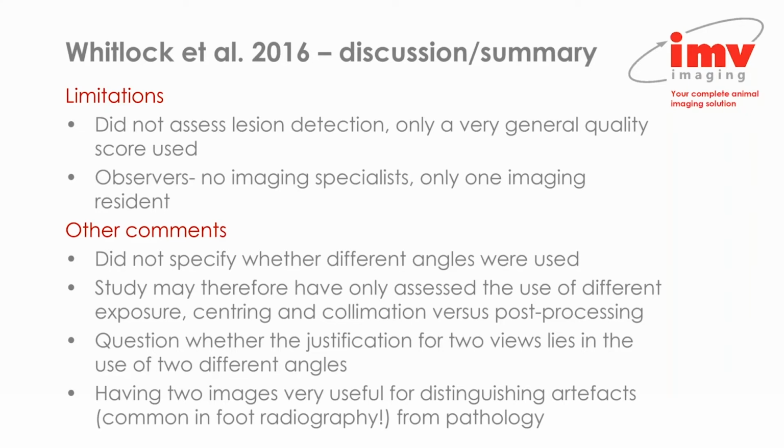So the study may have been only assessing the use of different exposure, centering and collimation versus simply doing post-processing on an existing view. And I would question whether the justification for using two views lies in the use of two different angles. Because I find that having two images acquired at different angles can be very useful for distinguishing between artifacts, which are very common in foot radiography, and pathology.